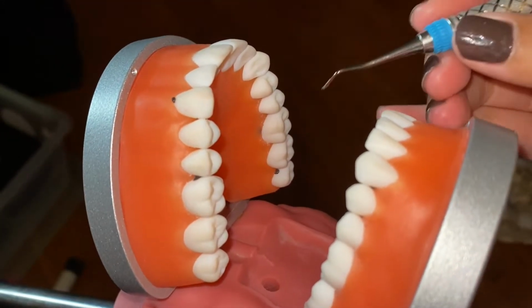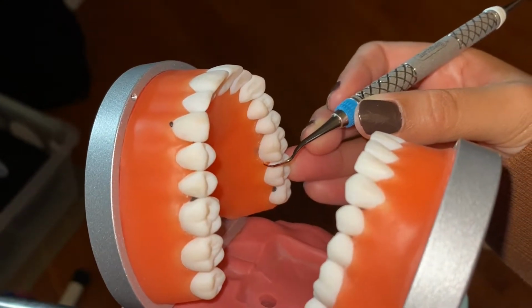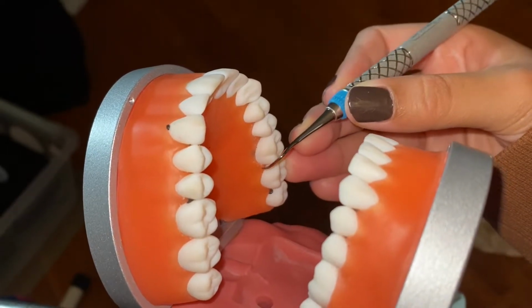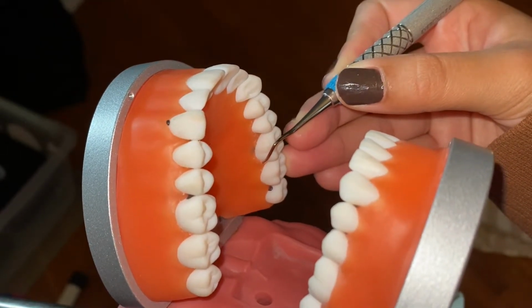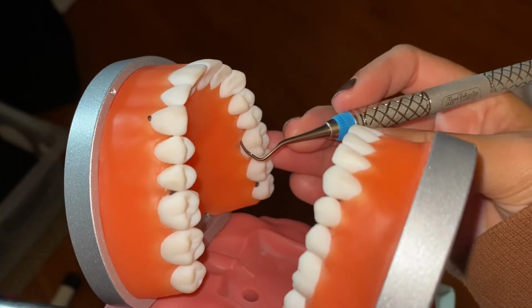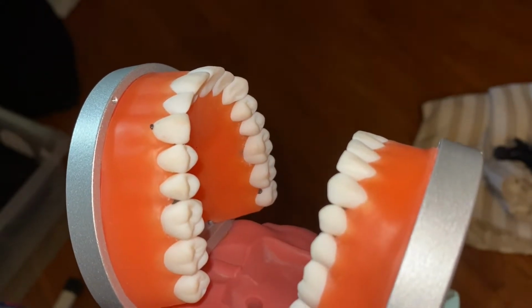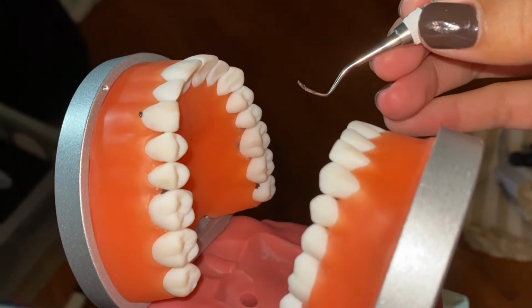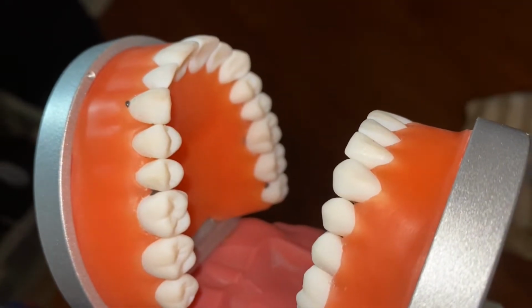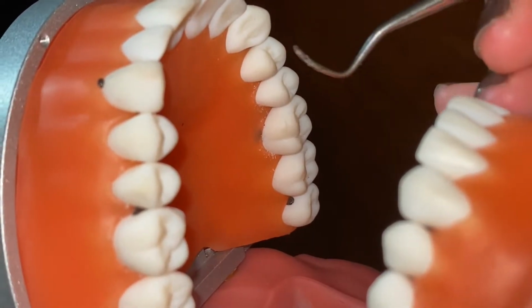For instance, if it was the incorrect working end and you tried to have your tip go in towards the distal, your terminal shank is now crossing over that lingual surface of the tooth, which is incorrect. And if you tried to do it towards the mesial, the face of the blade is facing away. So going back to the correct working end here. There we go. Okay.